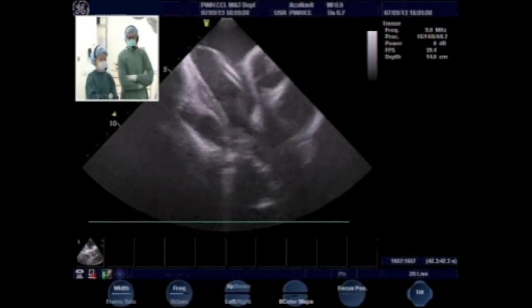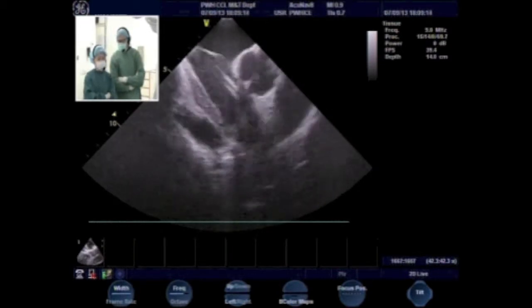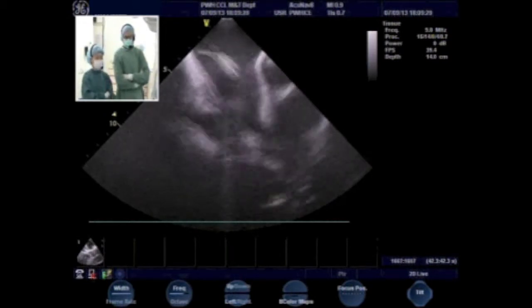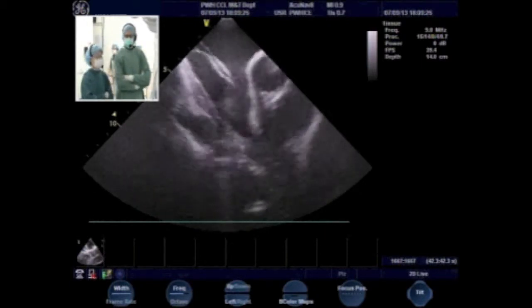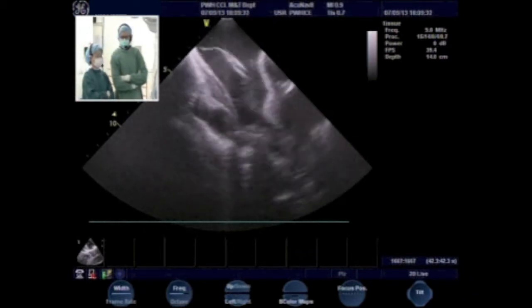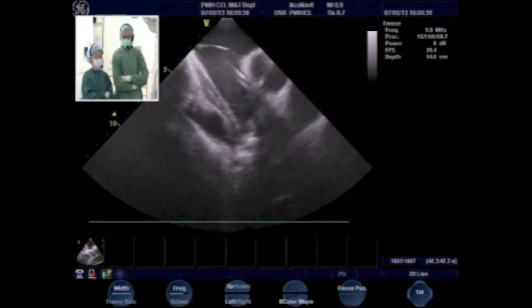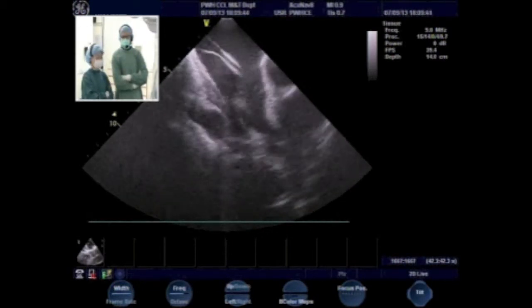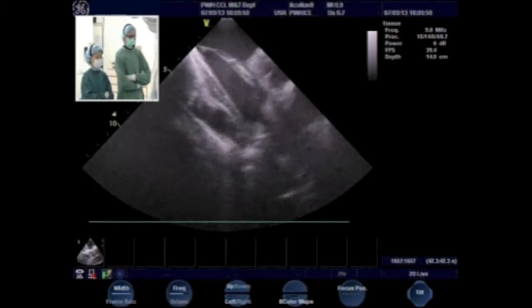The posterior inferior rim looks quite flimsy, and the retroaortic rim is a bit deficient. Exactly. So we'll proceed to do a balloon sizing of the hole with the stop-flow technique. Would everyone do that? Yes, I suggest to do it. Any other comment from the panel? This is Dr. Arita in Japan. To me, the posterior rim is really floppy. I think at least 20 or maybe 22 or so would be appropriate. Okay, but let's see the angiogram.